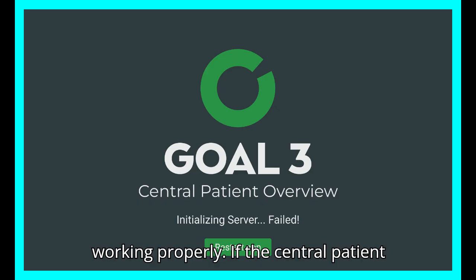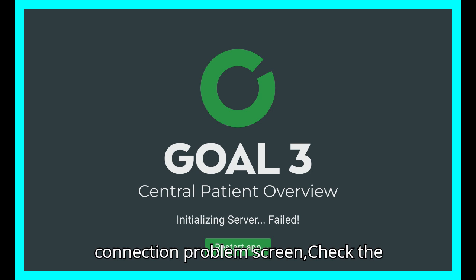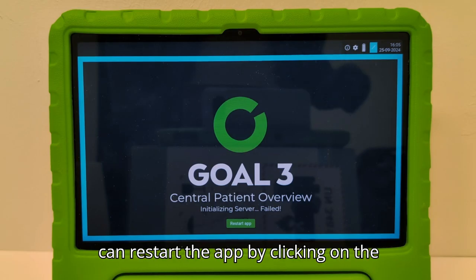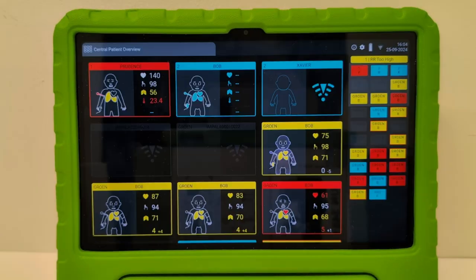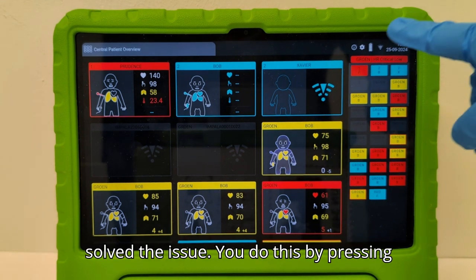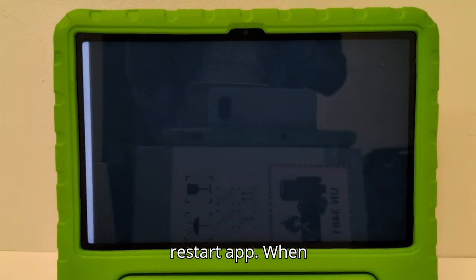If the central patient overview doesn't open and you see a connection problem screen, check the tablet's Wi-Fi connection and ensure the tablet is within the Wi-Fi range. You can restart the app by clicking on the Restart button. When the app shows unexpected behavior, you can also restart the app to check if this solved the issue. You do this by pressing the settings icon and then clicking Restart App.